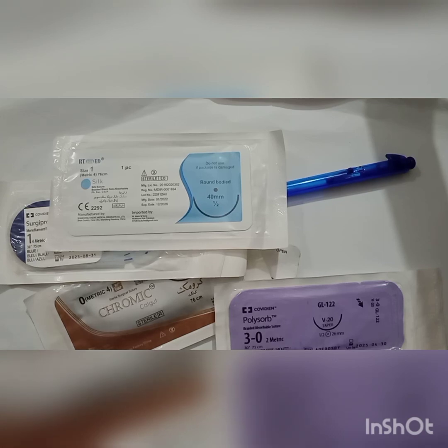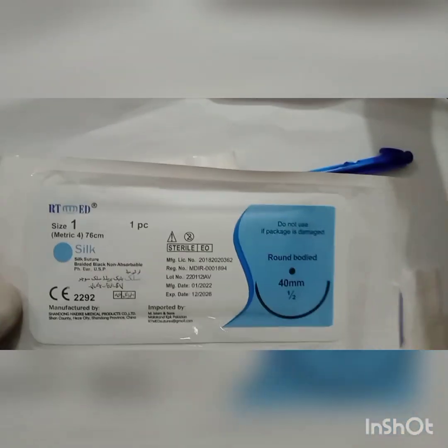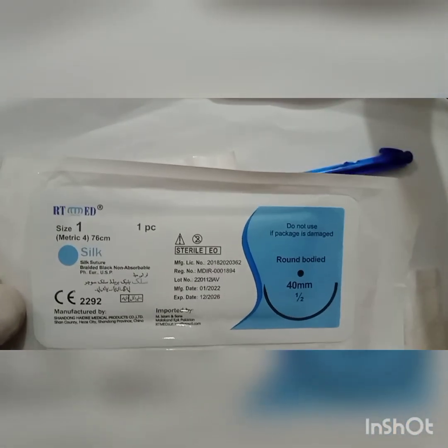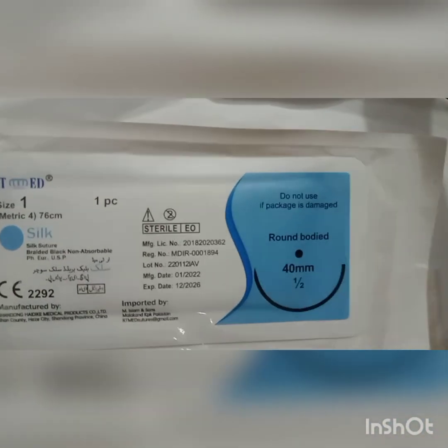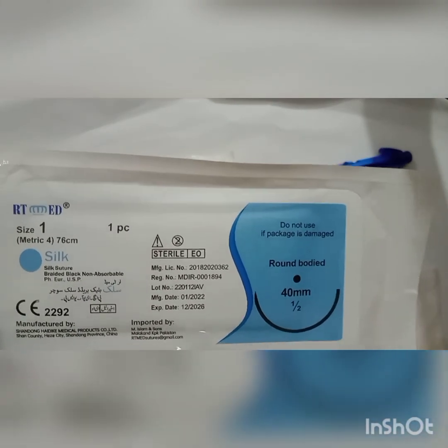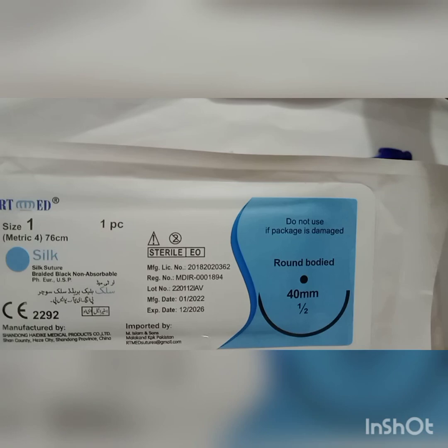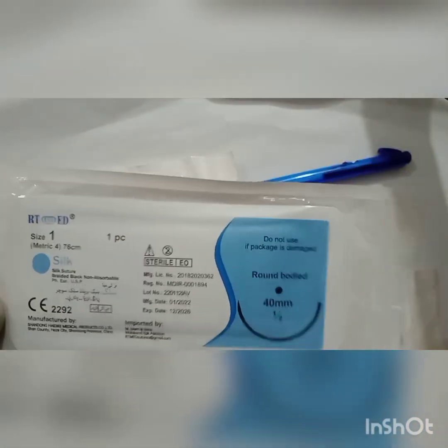The second important information given on the packing is the type of suture material. The type of suture material is important to be known by the surgeon, because different materials have different properties. It is very important to choose the proper suture for the proper tissue or proper wound.